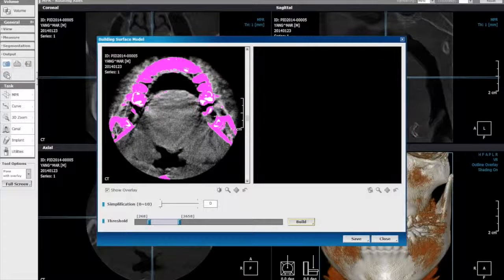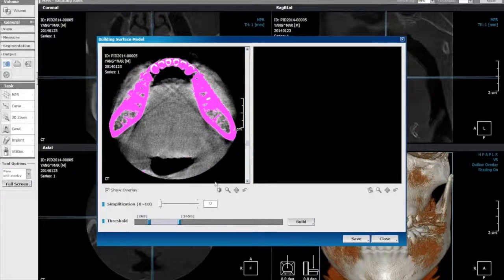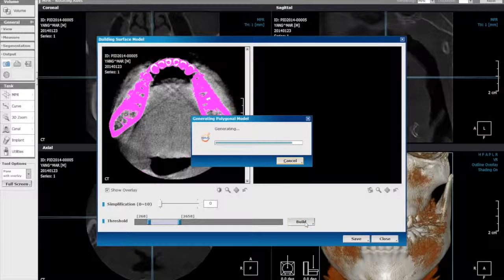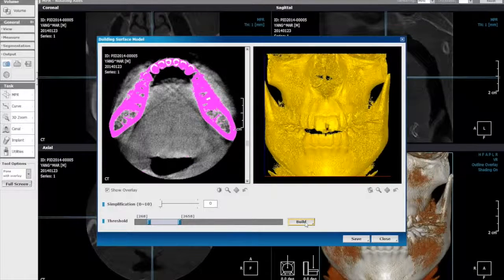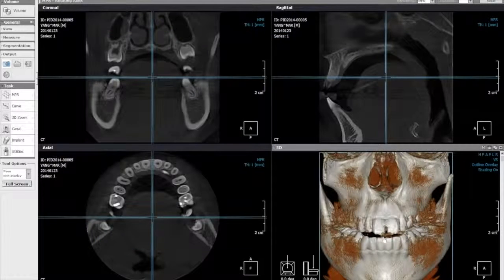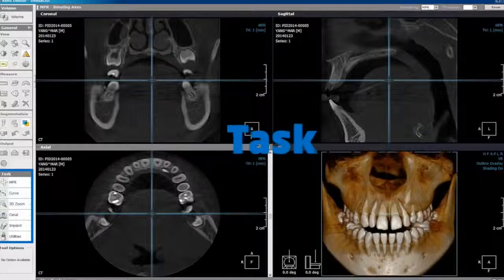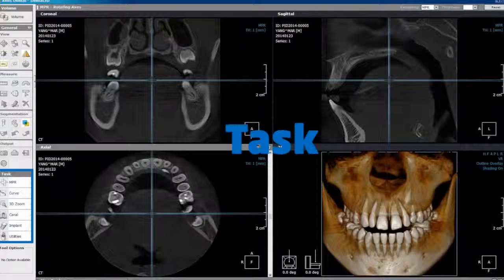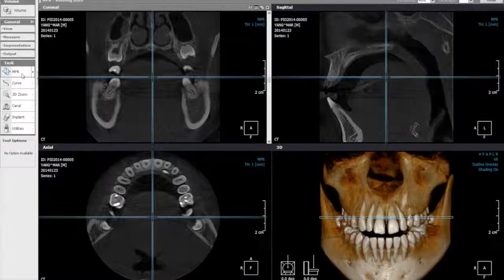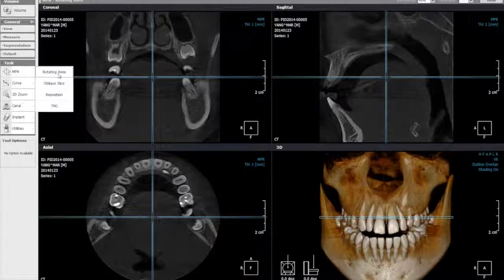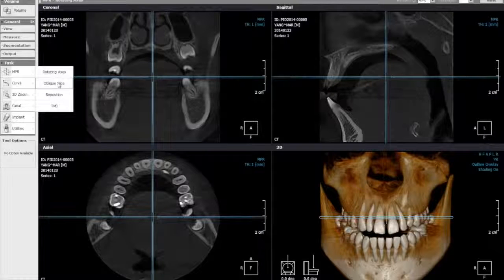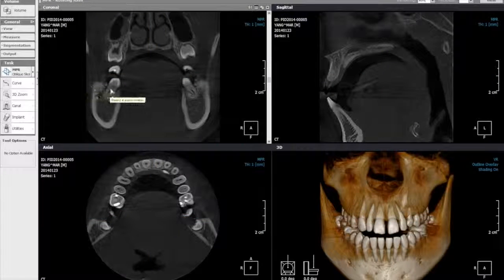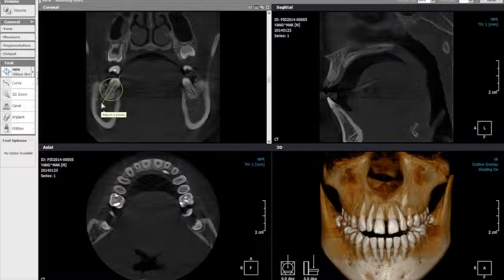Right of that is the save surface option. This function enables the volume data which makes up the 3D image to form mesh data, often called STL, that can be exported to other 3D viewers. The next section is for your MPR views under the task section. Whatever you are currently in is the rotating axis, or often called orthogonal view. You can go to oblique slicing, which gives you the ability to look at different cross sections you might not be able to see in its normal view.